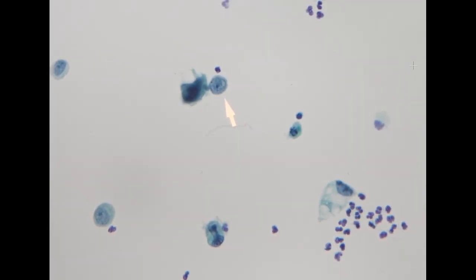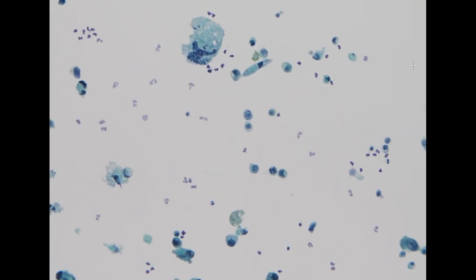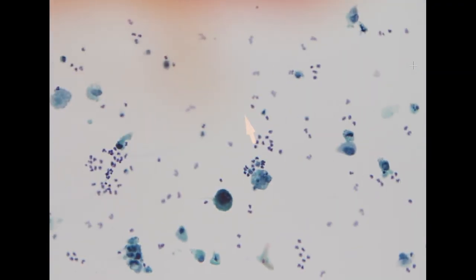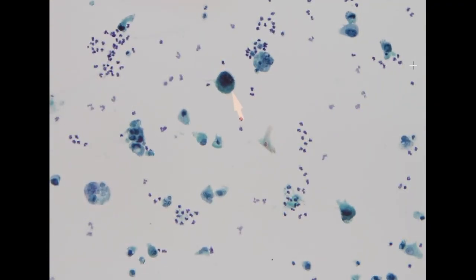We can also see some scattered cells with more preserved nuclei and chromatin, but with very, very high NC ratio. There were also some scattered, very bizarre cells. Despite the low NC ratio, you can definitely see the nucleus is not normal. It is also a malignant cell. So these ones as well. So this specimen is definitely positive for high-grade urothelial carcinoma.